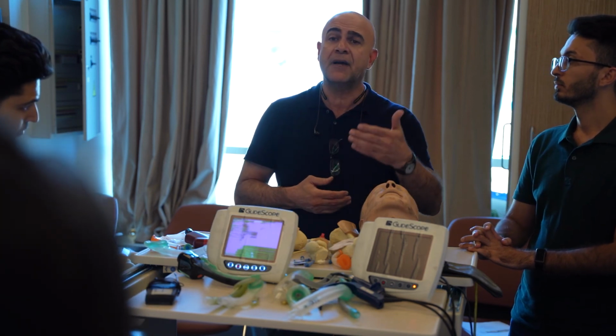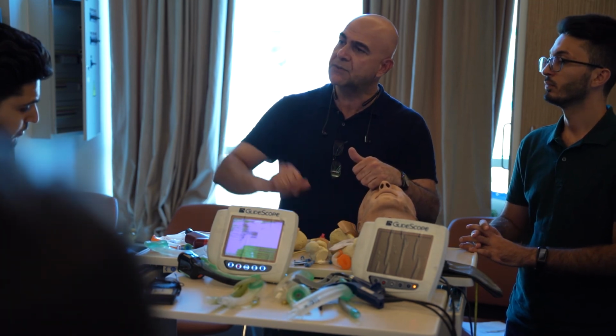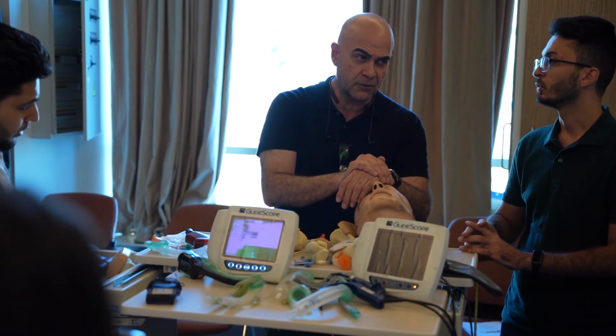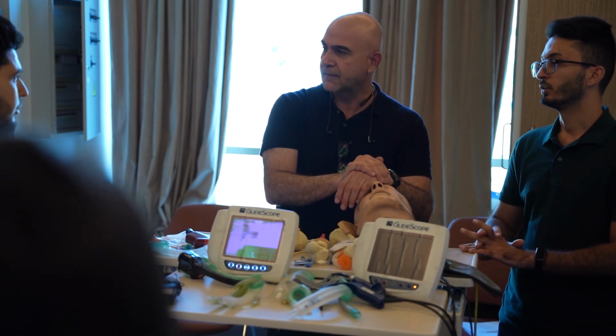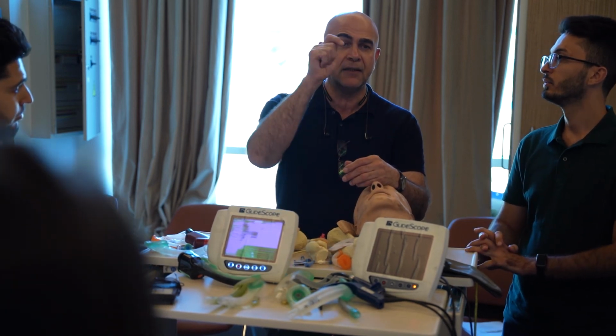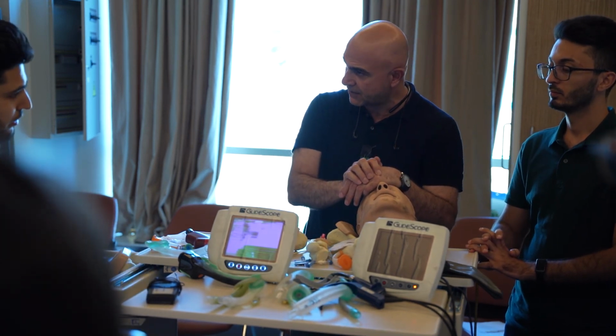Now, respiratory rate is 25. Still, you'll give oxygen. Respiratory rate 40, you'll give oxygen. Now, respiratory rate is 9. What will be in your mind? Unsatisfactory, the ventilation is failing. So you should give oxygen by ambu bagging, by assisted ventilation. Okay? Good.